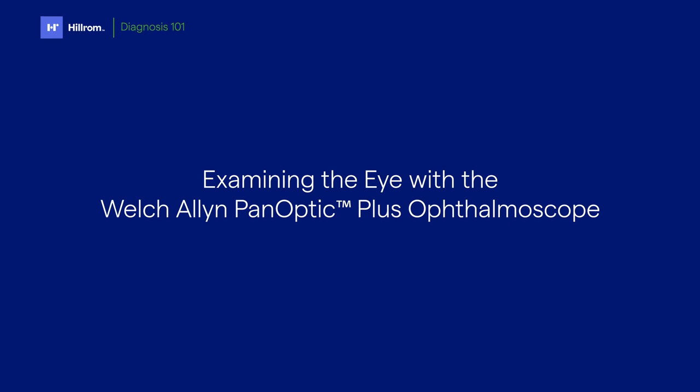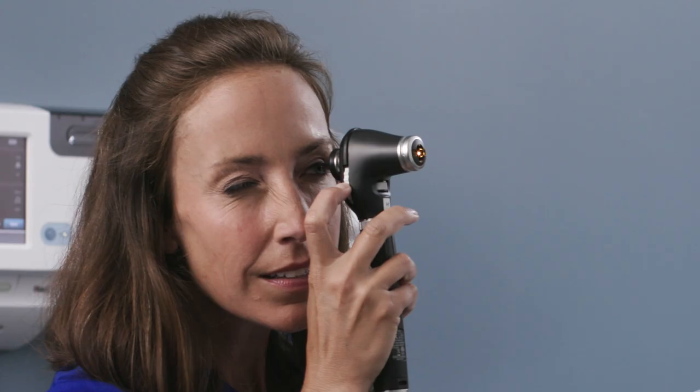Now let's move on to the exam. With any retinal exam, you may want to dim the room lights to help dilate the pupil and improve your view. To correct for your vision, look through the ophthalmoscope at an object that's at least 10 feet away, and adjust the focus wheel until the object you're looking at is in clear focus.